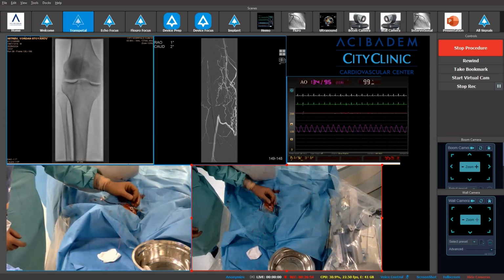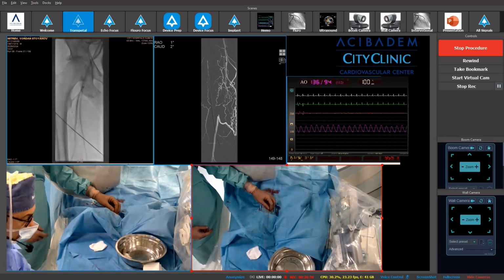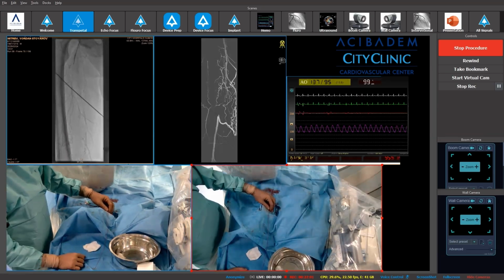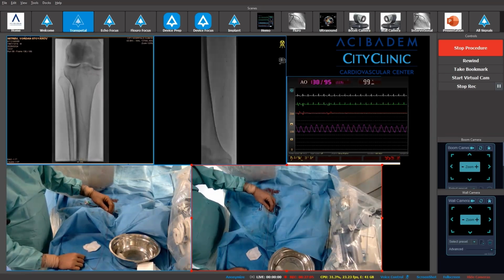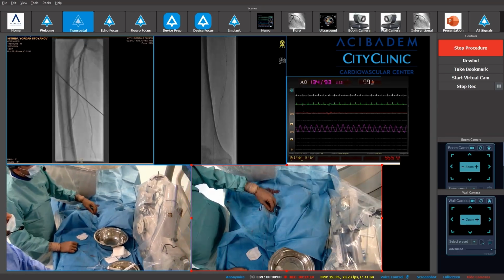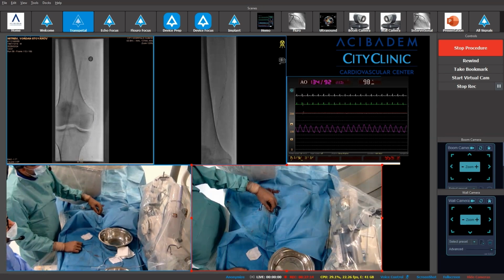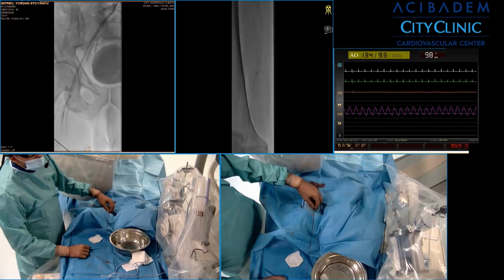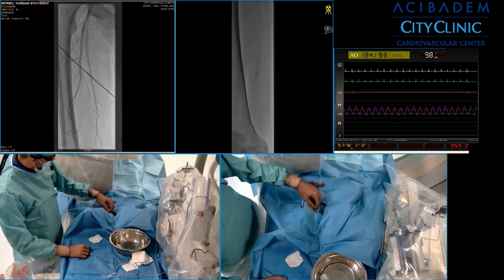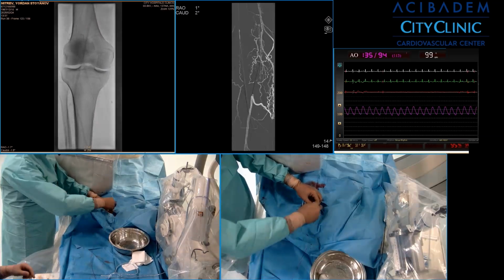And after putting the supportive wire, that is really excellent supportive wire, we are going to proceed with a non-compliant balloon. In case everything is going smoothly from a vascular point of view, we are going to avoid stenting, and we are going to finish with DCB, with drug coating balloon, with very good results, not only in the trials, but also in our experience.